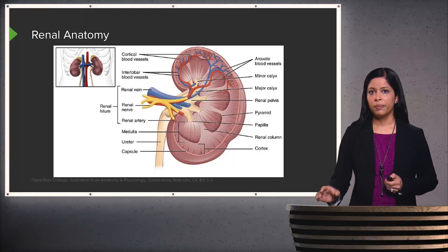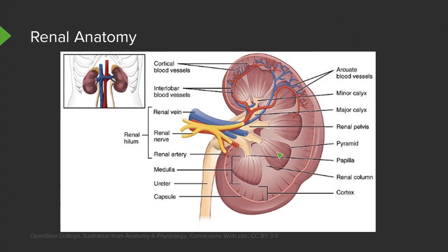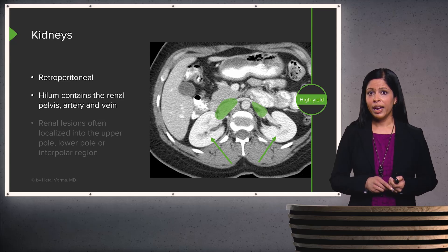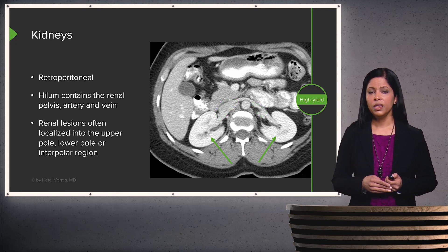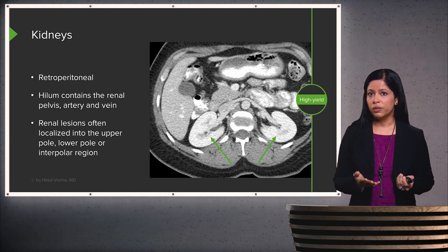The kidney has a cortex, multiple renal pyramids comprising the renal medulla, and the renal hilum where the ureter and blood vessels enter and exit. The kidneys are retroperitoneal organs. The hilum consists of the renal pelvis, the artery, and the vein — the pelvis drains into the ureter. Renal lesions are localized to the upper pole, lower pole, or interpolar region, which is located around the level of the hilum.